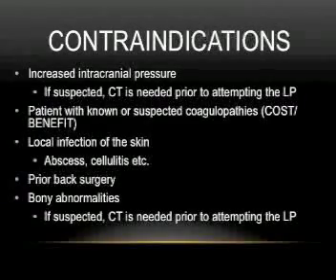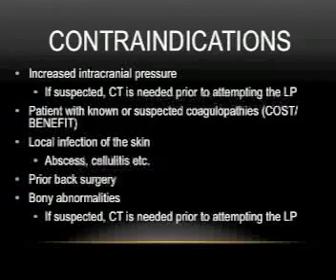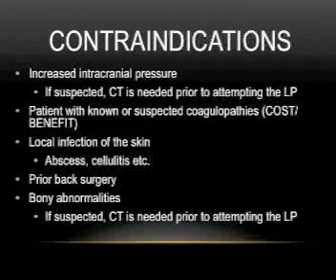You have to be careful with patients with coagulopathy or suspected coagulopathy such as hemophilia as well. Also, when a mass or lesion is suspected at the insertion site, it is suggested that a CT scan is obtained prior to the LP procedure.